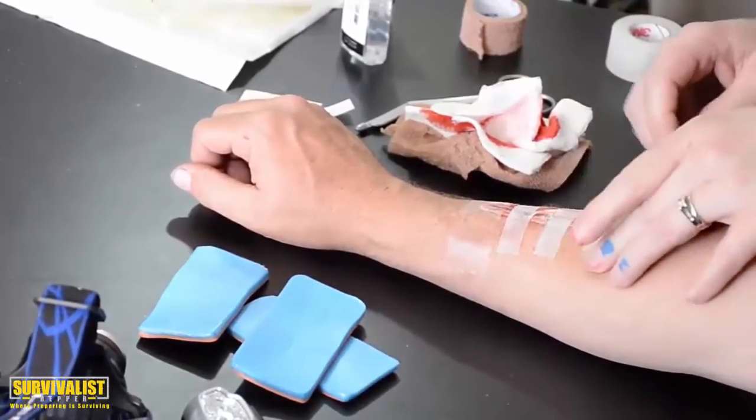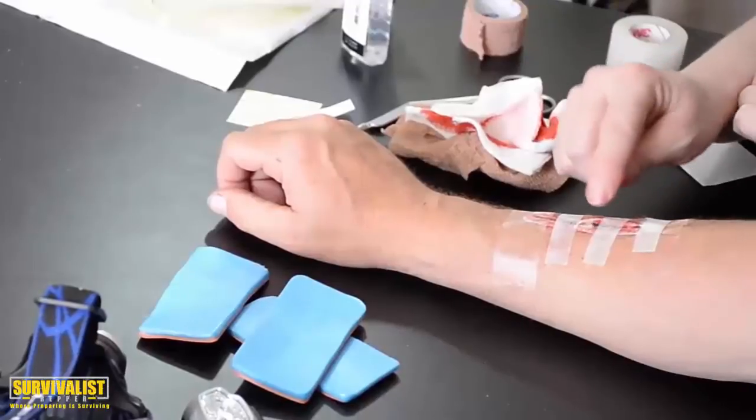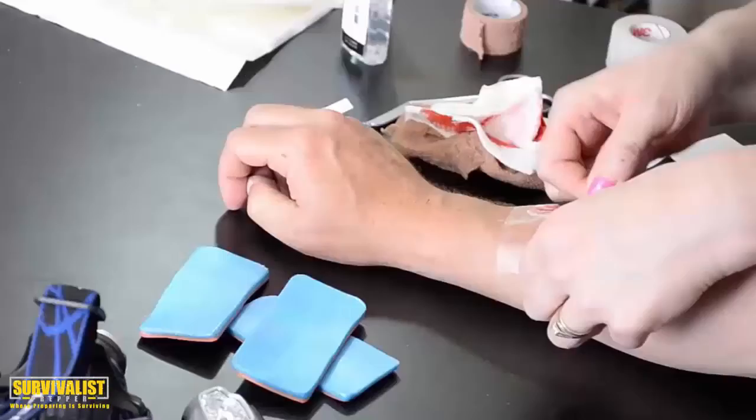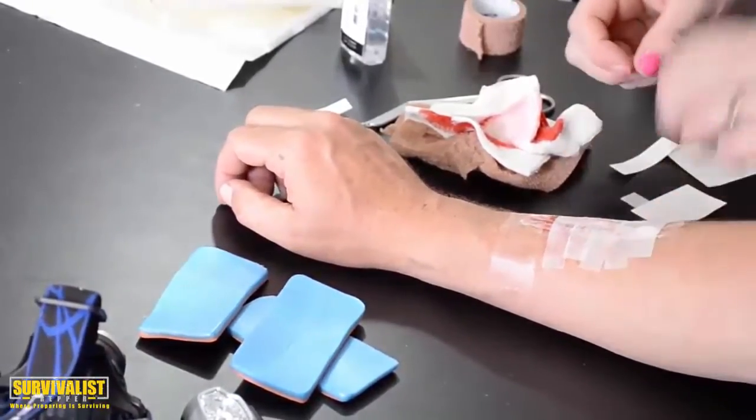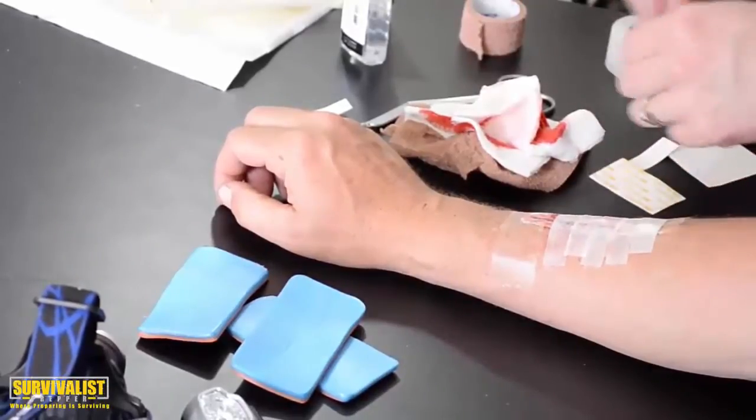Notice I've left gaps between the steri-strips — that's intentional. If there's any fluid or yuckiness inside, you want it to be able to come out. You don't want to seal the wound completely shut. That's also why you clean it before applying the strips — you don't want stuff growing inside and being trapped.